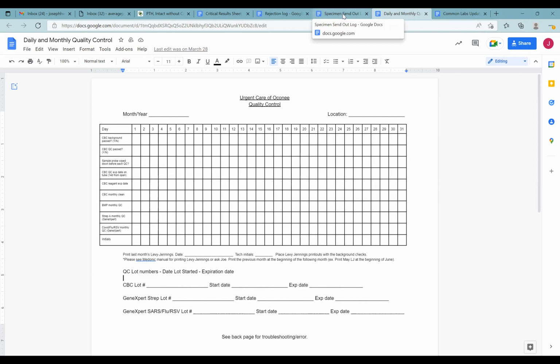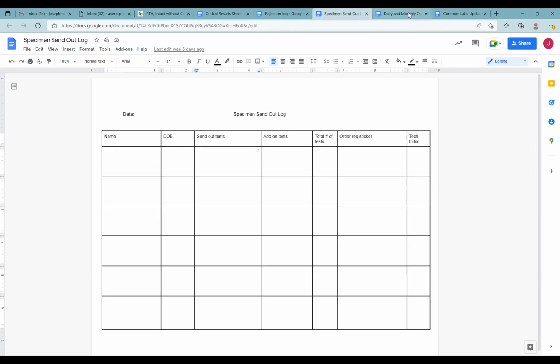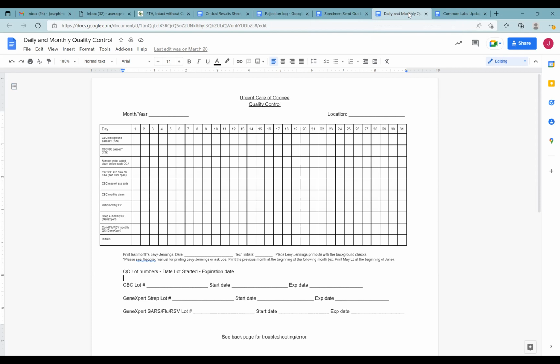Write needs QC on all those boxes, or that one big cardboard box that it comes in. And that's the other important thing: when you do QC a new lot, please write on there QC and the date, because a lot of times people will come back in behind you, see that QC is not written on the individual box, and then waste two cartridges running QC.